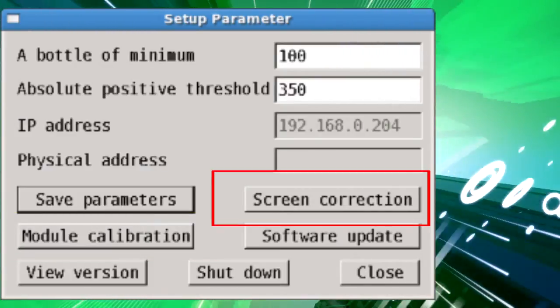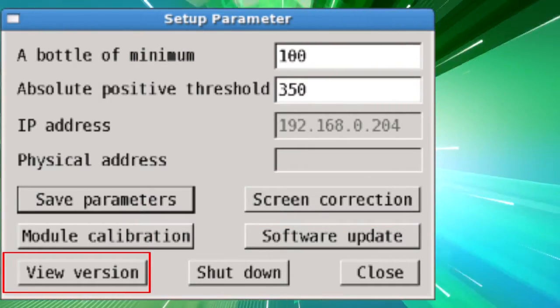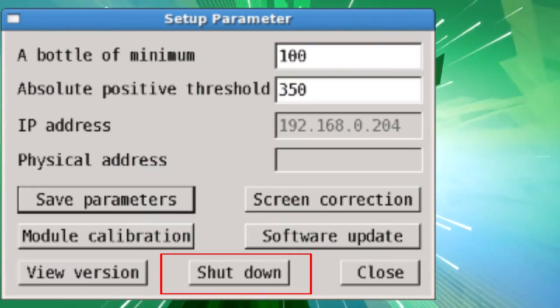Screen Correction is used to calibrate the accuracy of the touch screen. View Version allows you to view the current software version. Shut Down turns off the instrument.